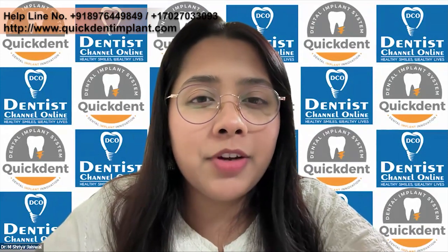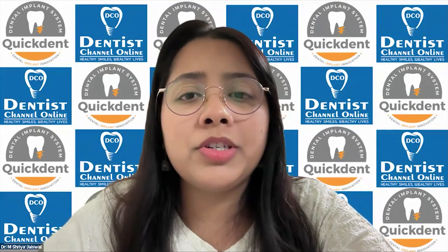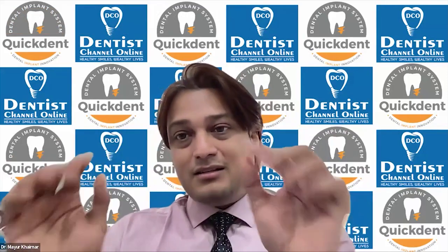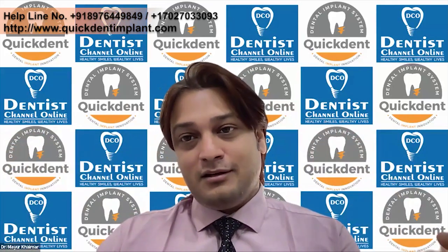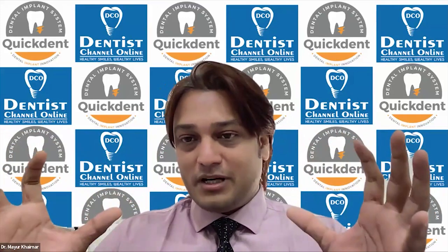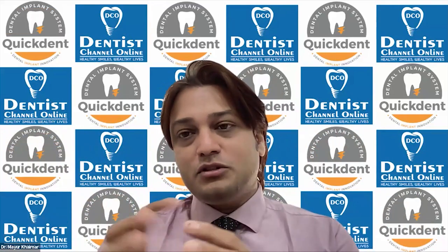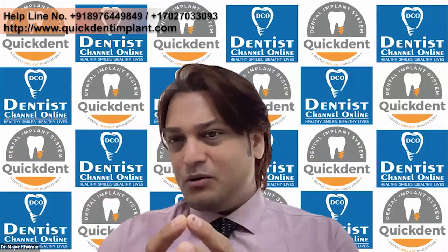Next is from Amit Gilani. They say feedback on hybrid prostheses is not good. What is your experience, that it soaks moisture, etc.? How long does it last? What you're describing can happen in cases where the teeth setting is done on the metal bar with the wax-up, and then it is acrylized into heat cure resin. That's a different way. However, what we have shown you here is two different materials. One is the metal which is printed through DMLS, and the other is the shell which is milled out of the material. These are two different things, so the chances of absorption will be minimum. I don't think that's a problem.